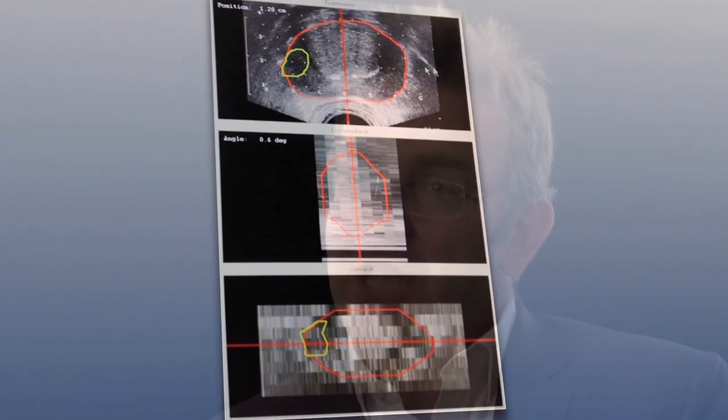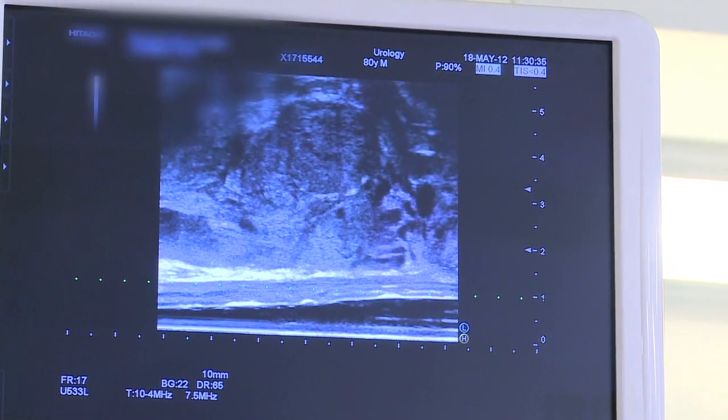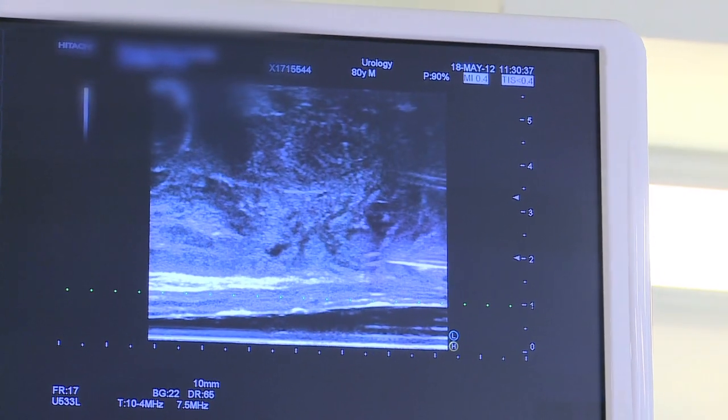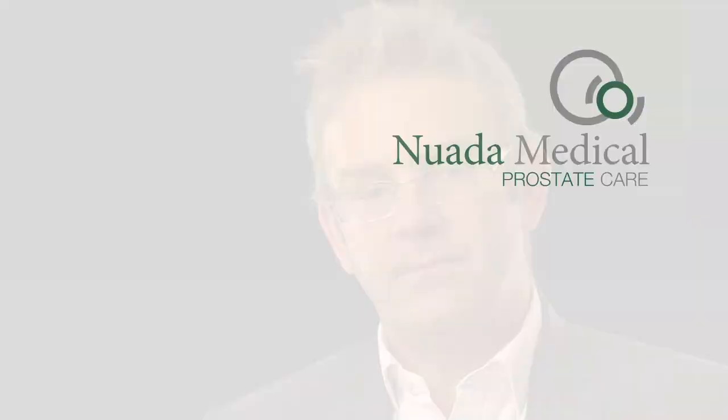In the brain, in orthopedics, actually in most of medicine, image fusion has been the norm for a long time. The challenges of applying an MRI onto an ultrasound data file have been quite challenging. Ultrasound is always quite difficult to work with. There are issues of orientation, there are issues of deformation, and there are issues purely of just number crunching in order to get these files to merge.